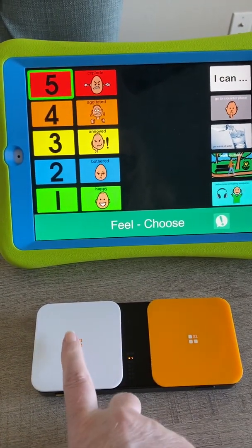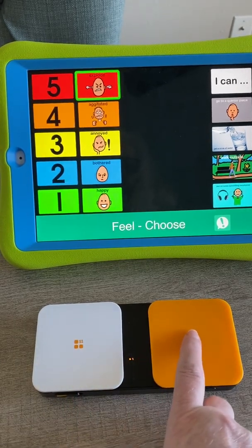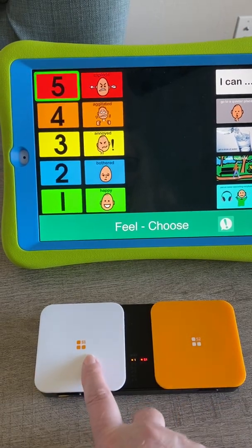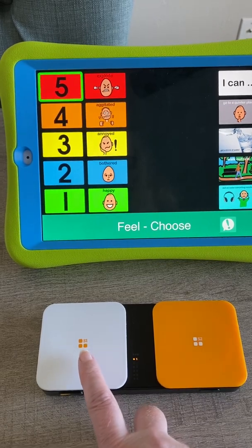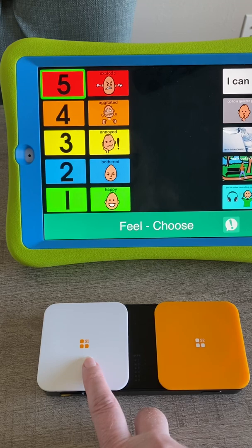So this one is my mover and this one is my chooser. You can adjust in those settings whether or not you start back at the beginning or whether you start where you left off.